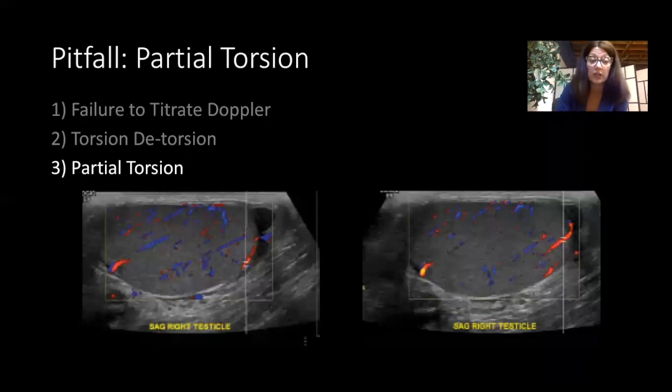In this case, if the clinical story was still suspicious, I again would still call urology, but you may have time to get that formal scan where radiology would do something called a resistive index with the spectral Doppler. And I can talk about that if there's time with the questions. I'm going to pass it along to Michelle Lee, who's going to cover lung and intussusception.